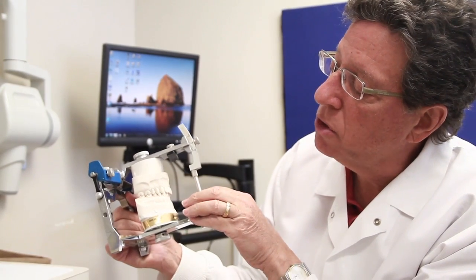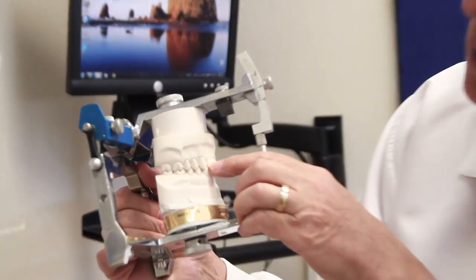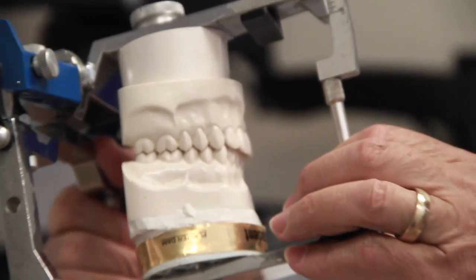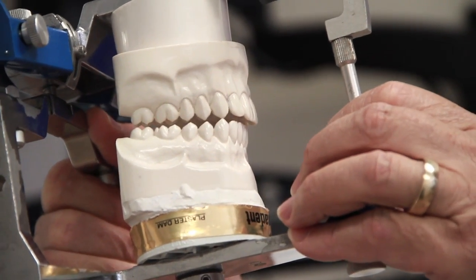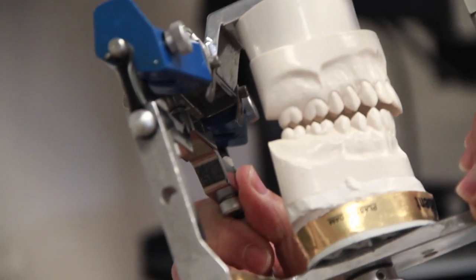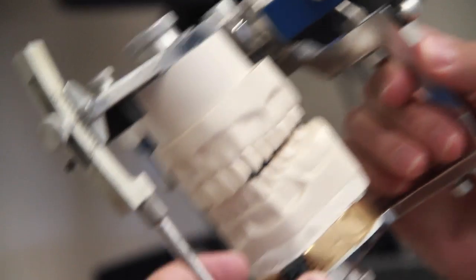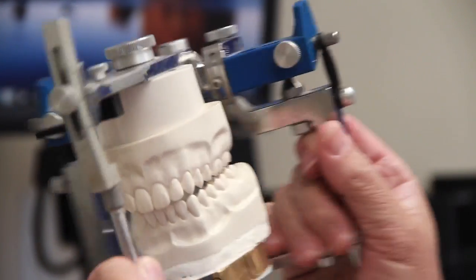And when you go into lateral excursions, because of the tightness of the occlusion at the canine region, it's very verticalized, and as soon as you move at all, there's immediate disclusion. At the test positions, there's very substantial clearance on both sides, left and right. And it's the same when you do the disclusion from the opposing canine.